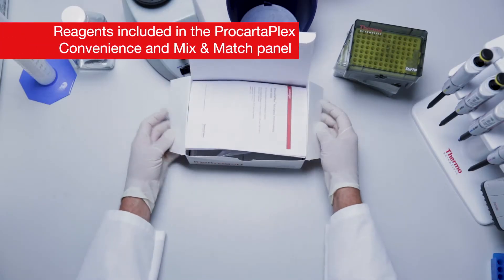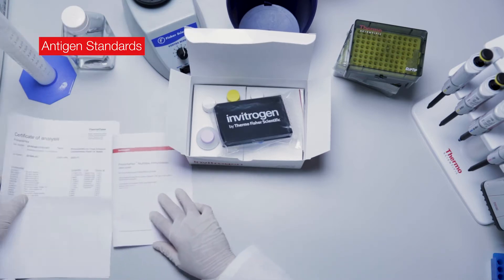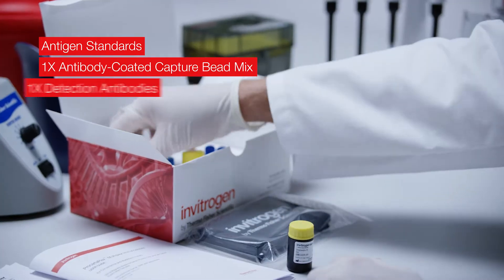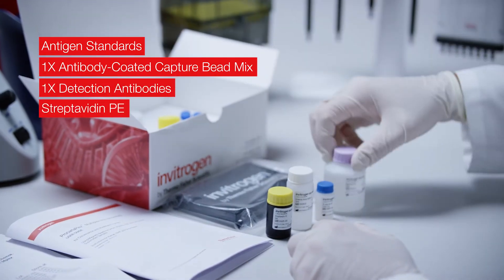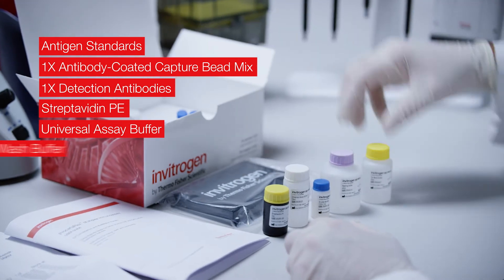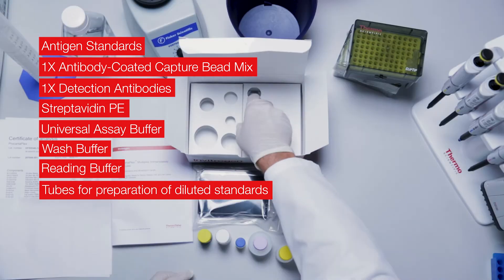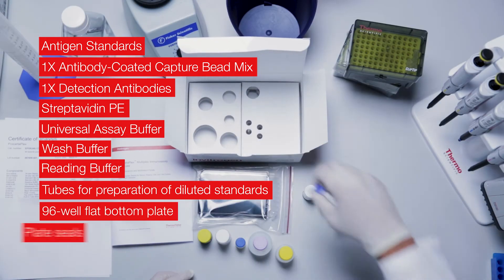The assay includes all necessary reagents. The kit contains antigen standards, 1x antibody coated capture bead mix, 1x detection antibodies, streptavidin PE, universal assay buffer, wash buffer, reading buffer, tubes for preparation of diluted standards, a 96-well flat bottom plate, and plate seals.